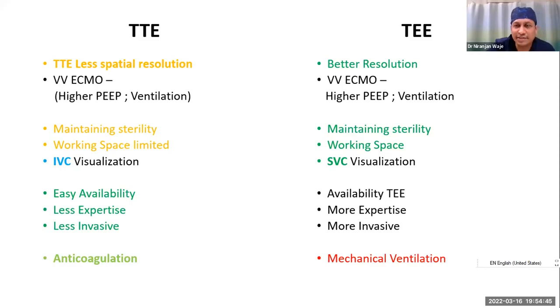Compared to that, transesophageal echocardiography has better resolution. It's the best modality to interrogate the mitral valve, the aortic valve, and anything in the posterior sector of the heart. It is the choice for that, and it will give better imaging in ventilated patients. Since it does not interfere with the surgical field where the surgeon is, it has the scope of maintaining better sterility and better working space.